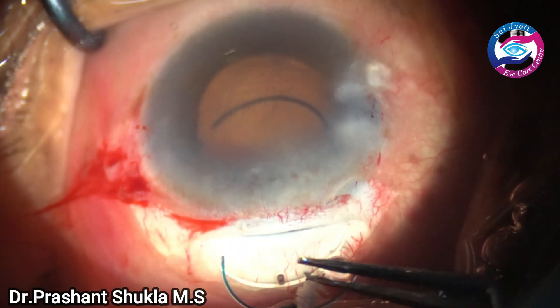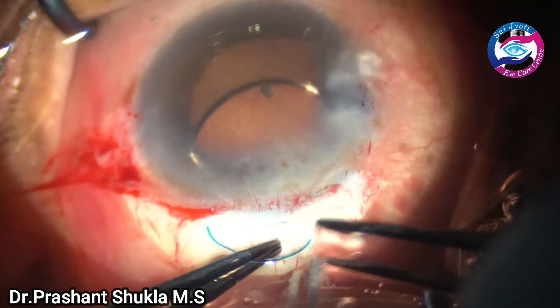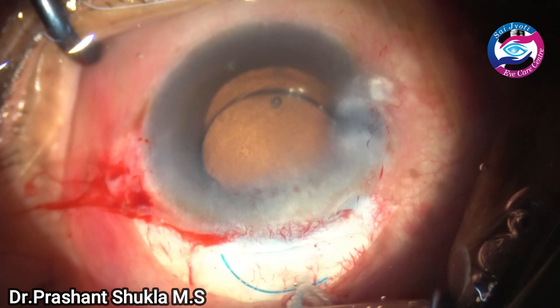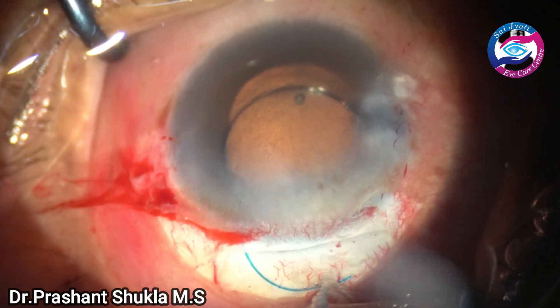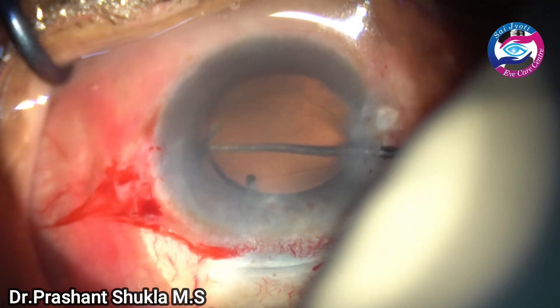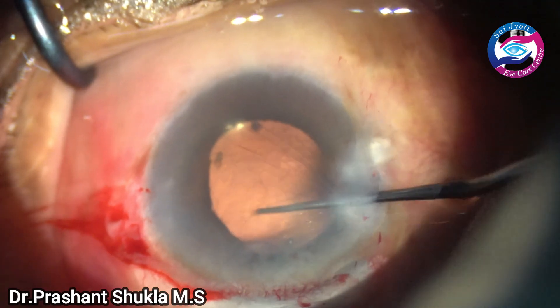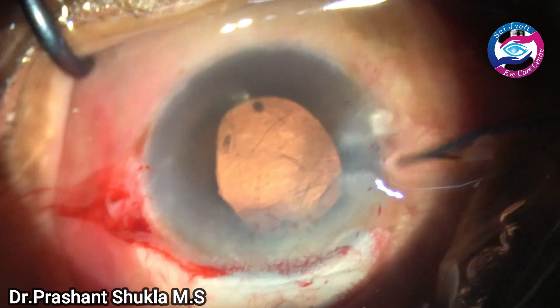Some dispersive viscoelastic is layered over the cornea to aid visualization, and here I am taking a three-piece PMMA intraocular lens. The leading haptic goes into the capsular bag below the anterior capsular margin. I have switched on the retroillumination stereo coaxial illumination mode of the microscope to see exactly where the haptic is going — this gives a very nice red reflex. The trailing haptic is then gradually dialed into the capsular bag. The lens is well centered and both haptics are in the capsular bag. The lens is moved into the correct orientation.